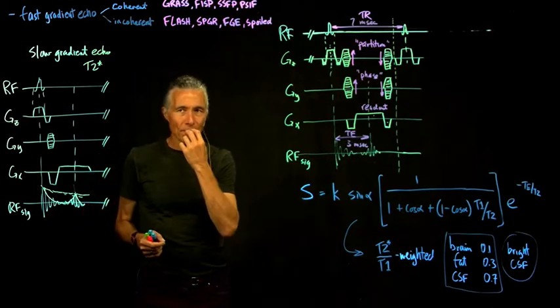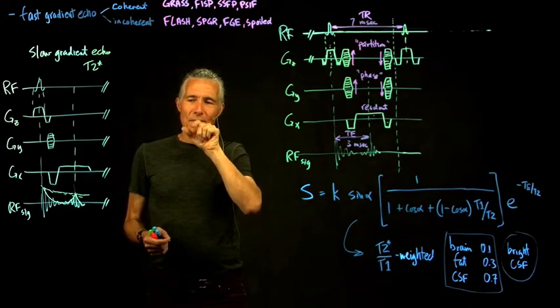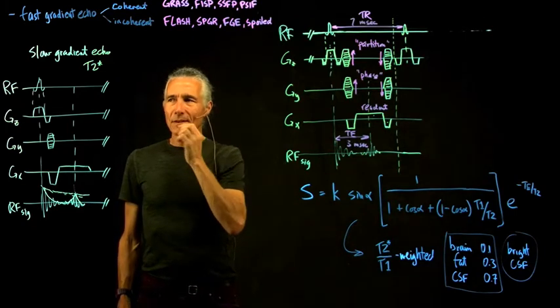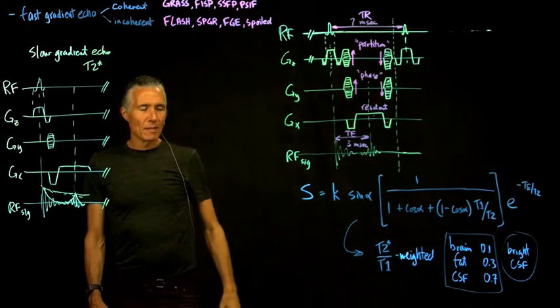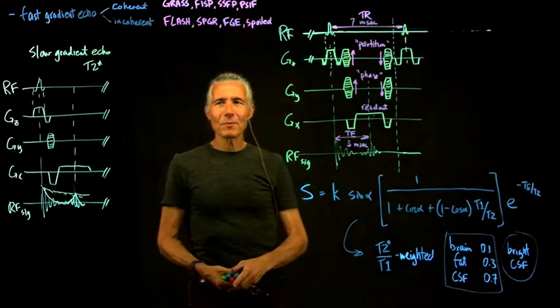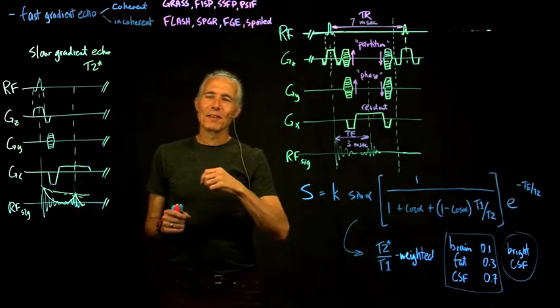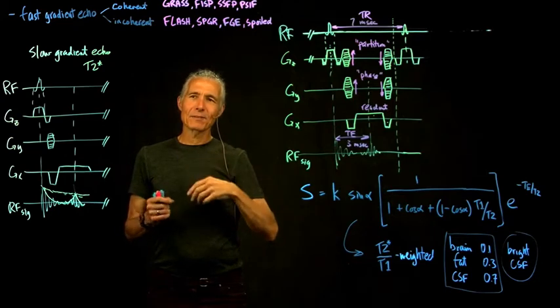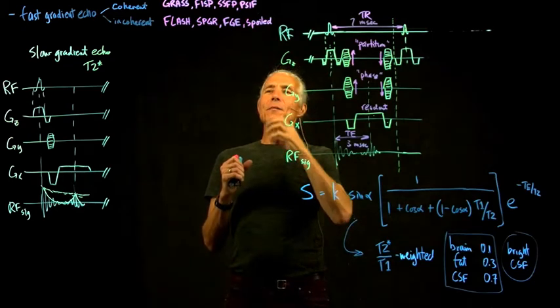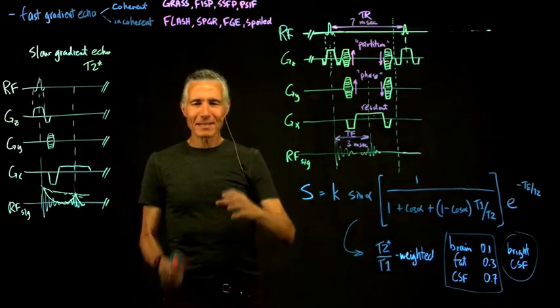And so that's fast enough that you can actually visualize the movements of the tongue in the scanner. So we had people pronouncing different consonants, and you can actually see the tongue moving in the scanner. I remember we got a presenter from the BBC, and she went in the magnet, and we tested this outside the magnet to make sure she wouldn't drown in the magnet, and she first lay on her back and swallowed a banana milkshake, and that was an amazing movie.